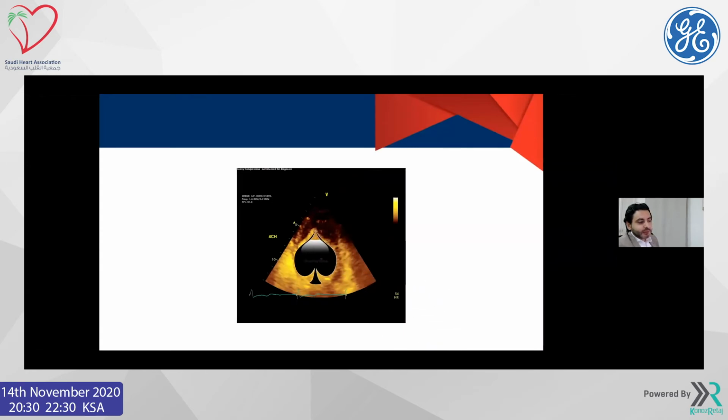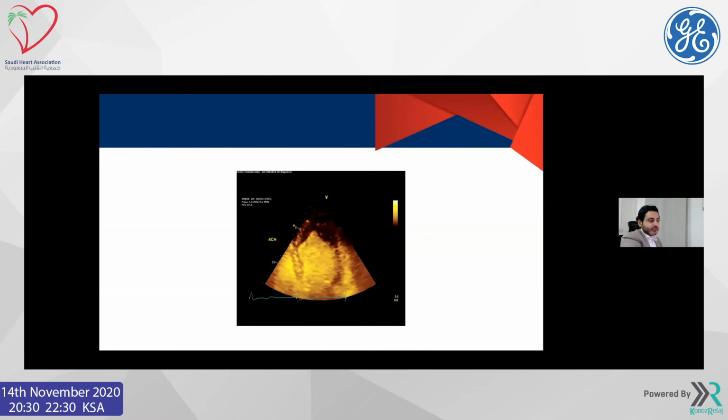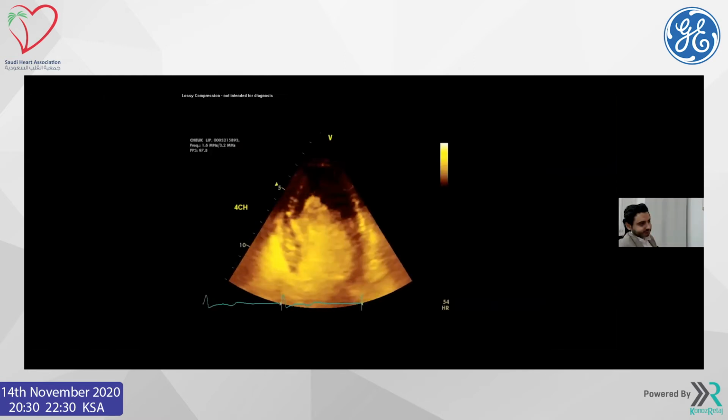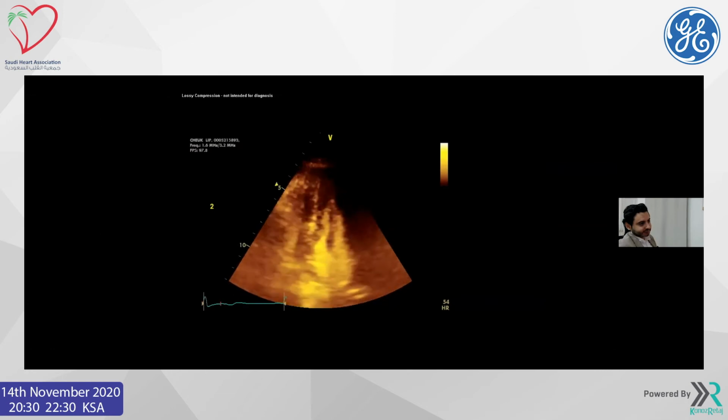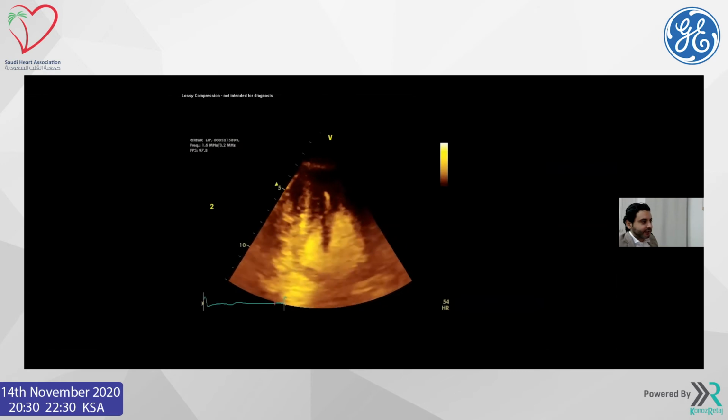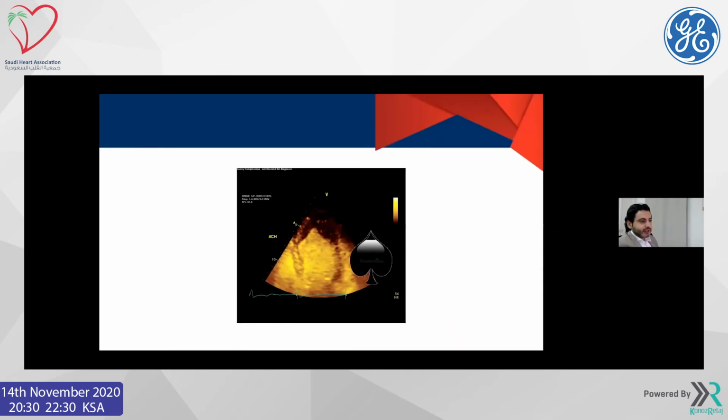See that spade, because we play cards, we know what the spade sign is. Run it, because we didn't see the second one in spade shape. Let it run a little bit. Yeah, this one. The next one. So this is very nice. This is a 2-chamber. And this is the spade.